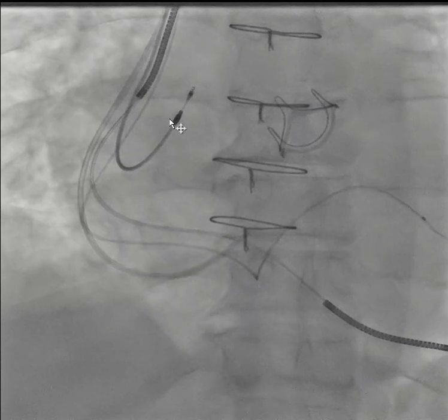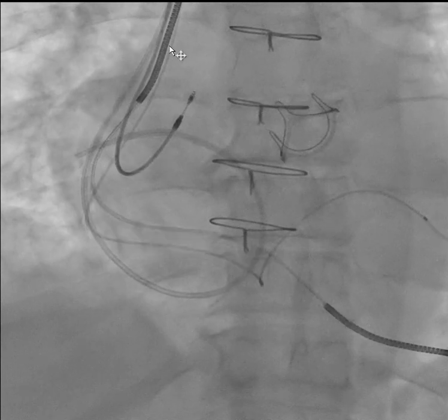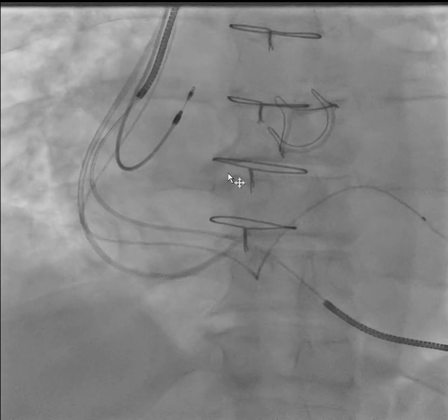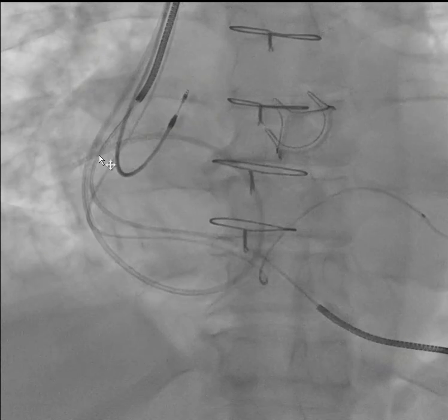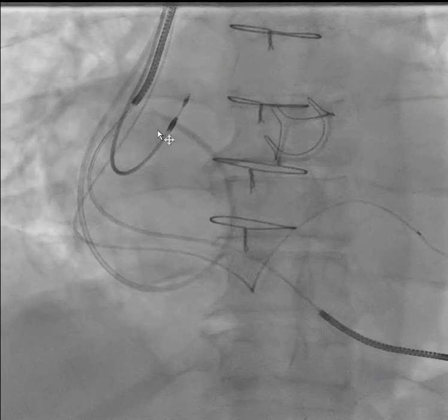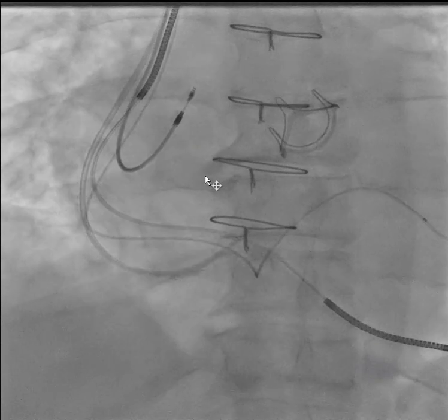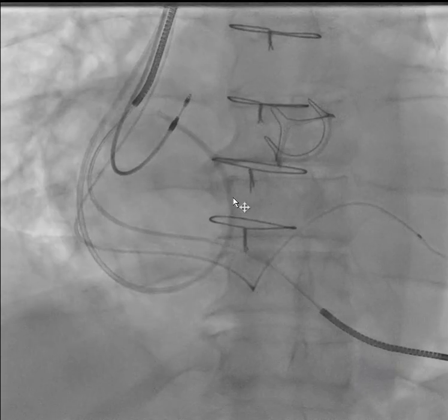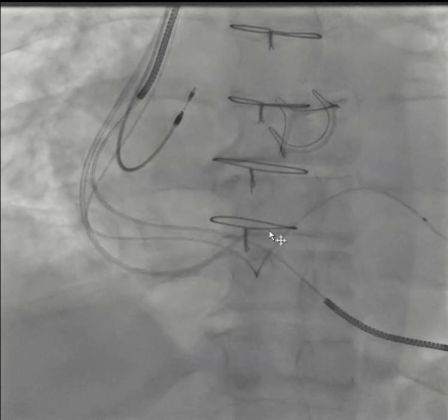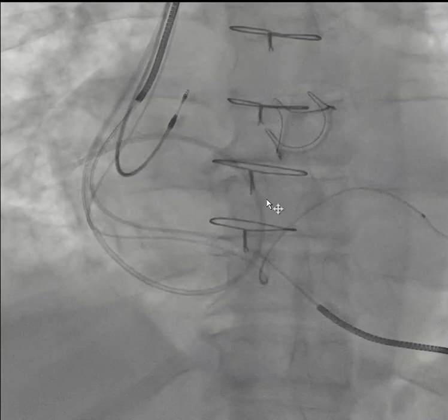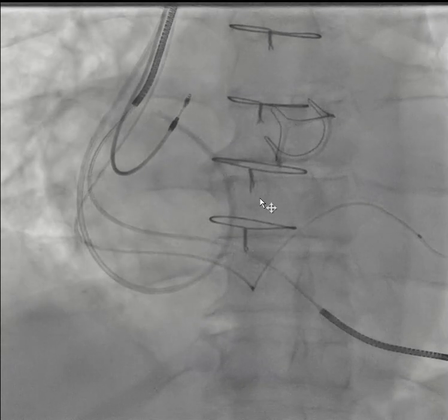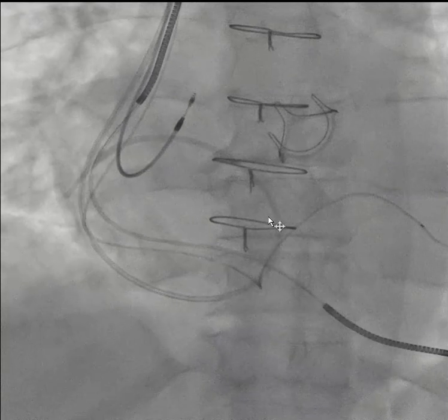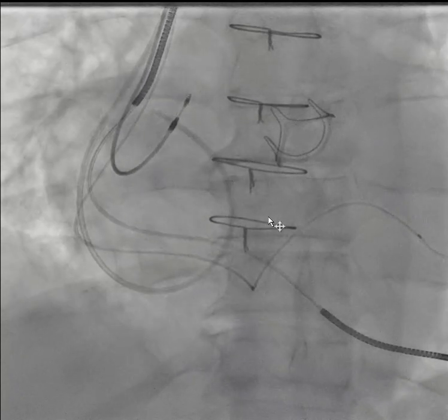I'm using a technique where you curl the catheter and then deflate the balloon. As you deflate the balloon, the catheter falls. You can see at the end there is a drop of the catheter into the right ventricle.